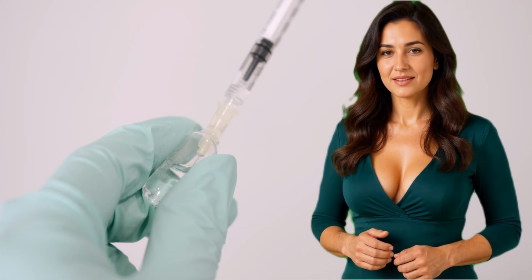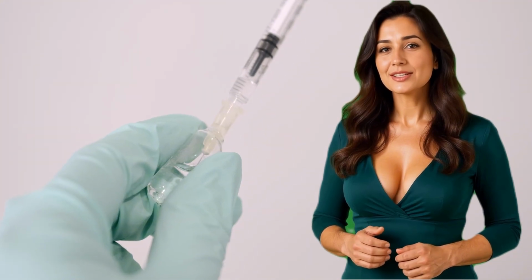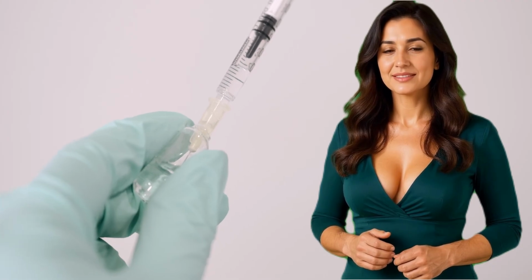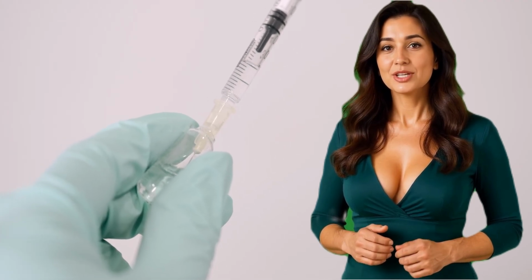Throughout the procedure, closely monitor the patient's condition. If the patient reports pain, dizziness, or discomfort, stop the procedure and assess the situation.